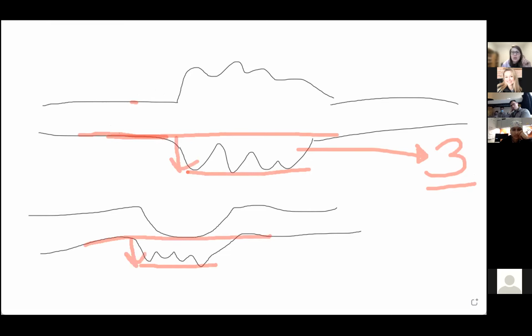Because if you regard this exophytic component as part of the lesion, your depth of invasion is going to be increasingly large. And if your ulcer is very deep, for example, then your depth of invasion may be increasingly or decreasingly short, right? So you may under- or overcall how much this tumor actually proceeds to invade into tissue if you don't consider what's growing out into the surface and what's being ulcerated, right?